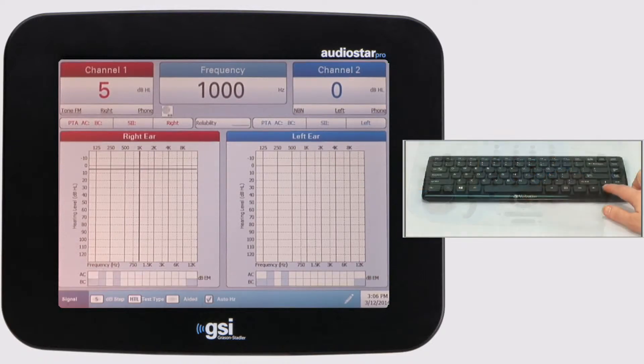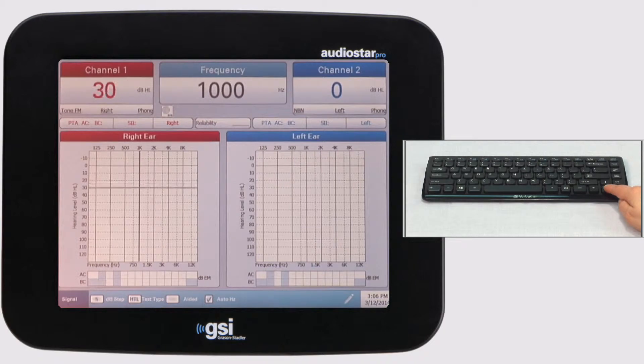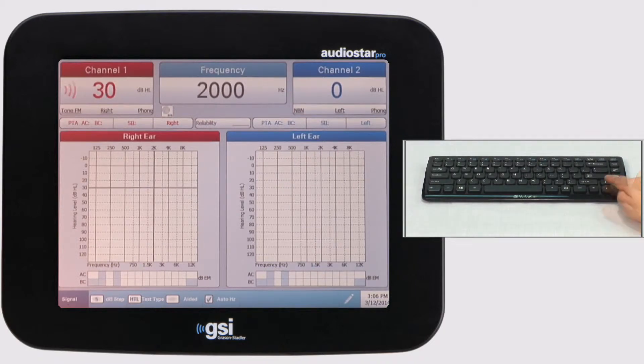Additionally, remote testing capabilities using a wireless keyboard have been implemented. Specific keys, when pressed, activate specific functions on the audiometer.